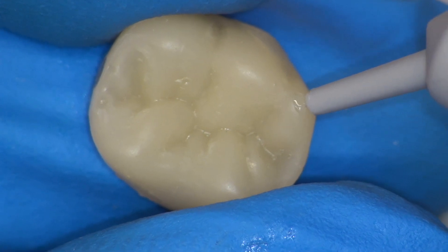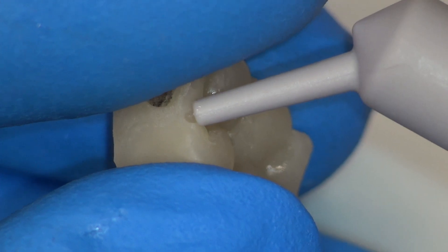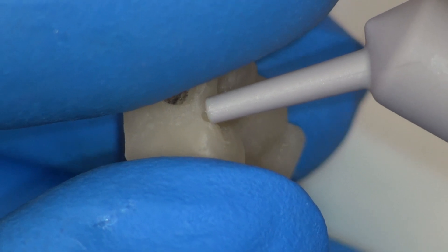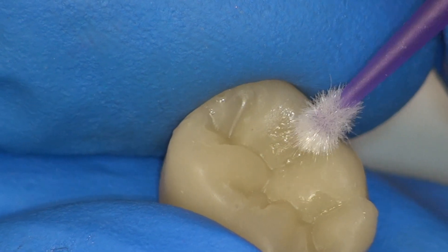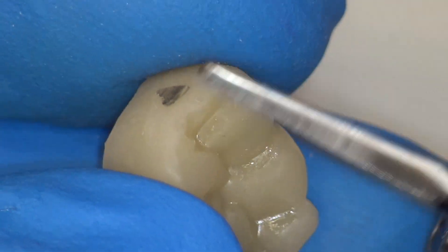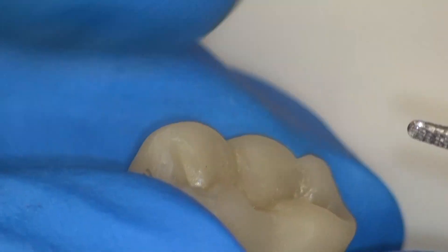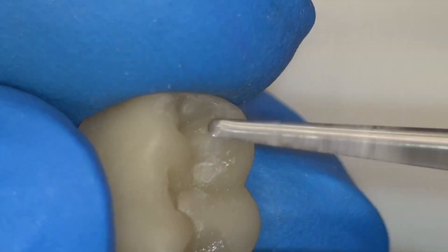Minor voids can be quickly repaired with flowable composite resin. A bonding agent is not required for this purpose. Excess flash is removed with the e-cutter.